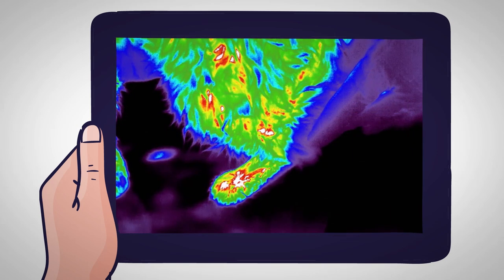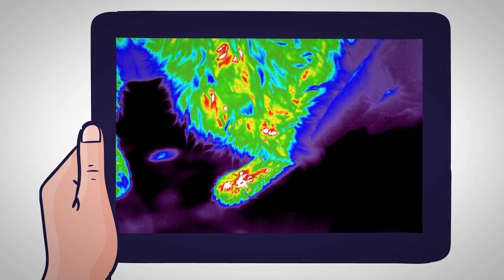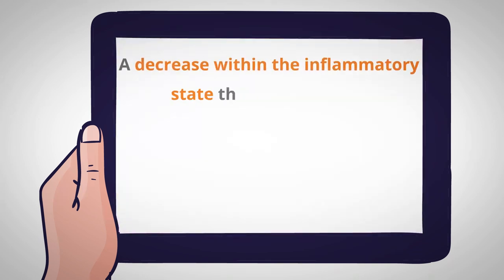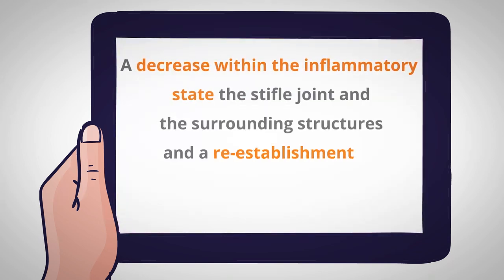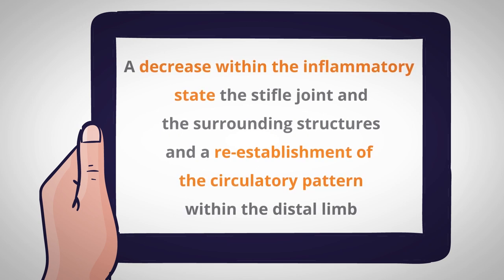The left stifle underwent a 96% decrease within all of the hyperthermic areas observed originally. There was also an increase within the thermal gradients associated within the phalangeal structures. Interpretation: a decrease within the inflammatory state of the stifle joint and the surrounding structures, and a reestablishment of the circulatory pattern within the distal limb.